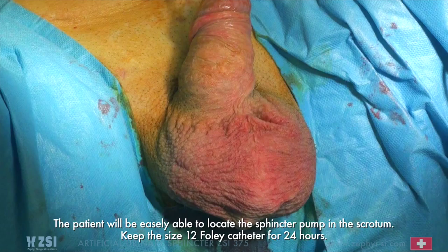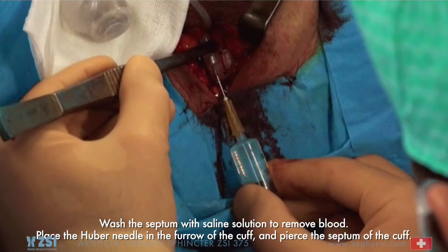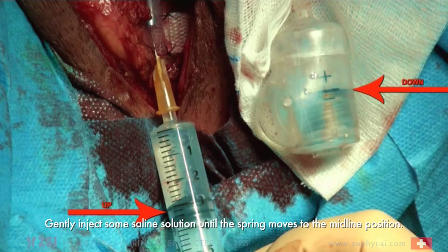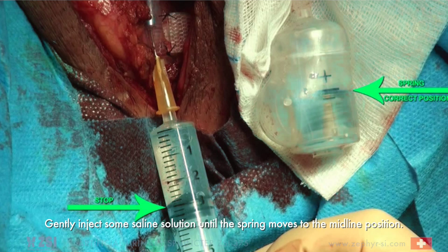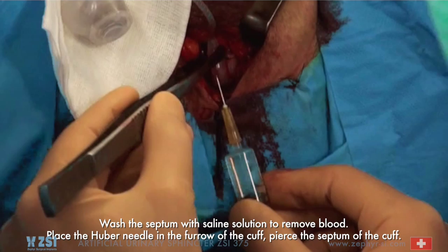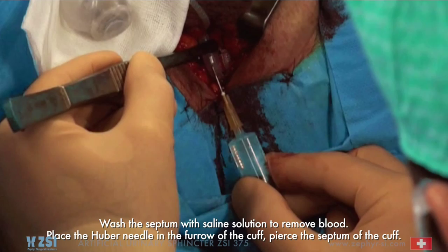Troubleshooting. Case 1: If the spring is over-released, place the spring at or just below the midline. Wash the septum with saline solution to remove blood. Place the Huber needle in the furrow of the cuff and pierce the septum of the cuff. Gently inject some saline solution until the spring moves to the midline position. Alternatively, gently remove some saline solution until the spring moves to the midline position.